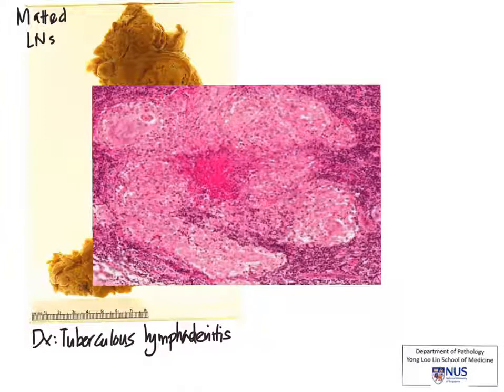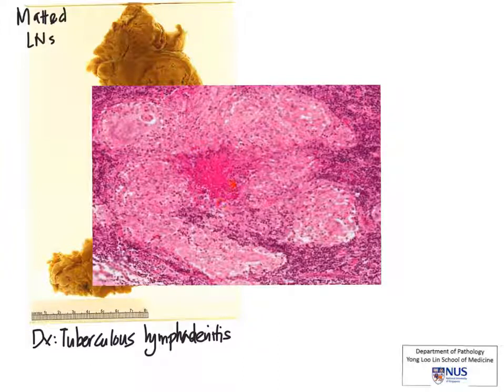One of the most classical things we will see is this whole collection of plump cells, which are called epithelioid histiocytes. Therefore, these are granulomas. And if you're observant, you'll actually see a little pinkish area here — this is caseous necrosis. So in other words, we are looking at necrotizing granulomatous lymphadenitis.